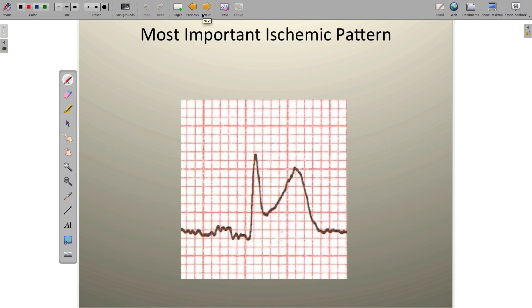We talked about ischemia and all of the many presentations of ischemia on the EKG in the last video. Now we have to narrow down all of the ischemic patterns to the most important one, which has a time-sensitive treatment associated with it — primary PCI or angioplasty. The most important ischemic pattern we need to recognize is called ST-segment elevation.